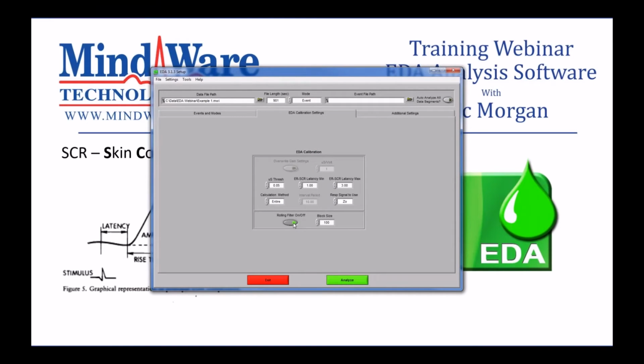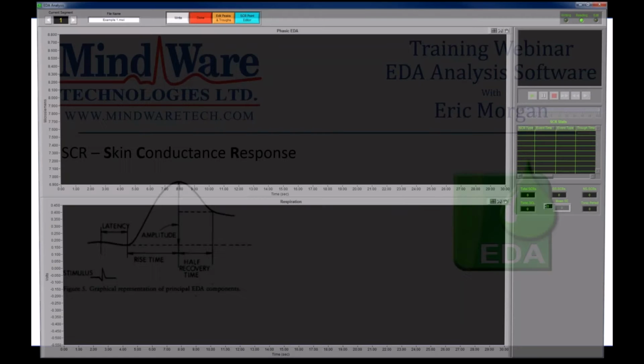Now, if you read the blog, you can get some more specifics on why we do this, but we're going to start with our block size being equal to our sample rate. That's a good starting spot for how much data to take and average. And you really don't want to go any higher than 2 times your sample rate. The sample rate of this file is 500, so we're going to set it to 500. And I'm going to go back to that segment.